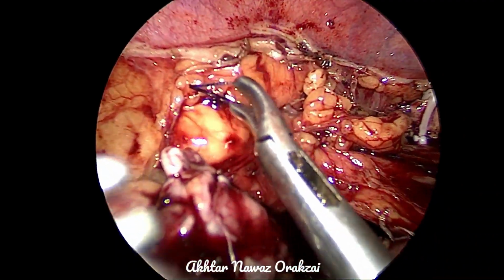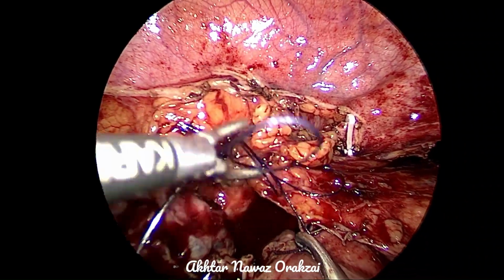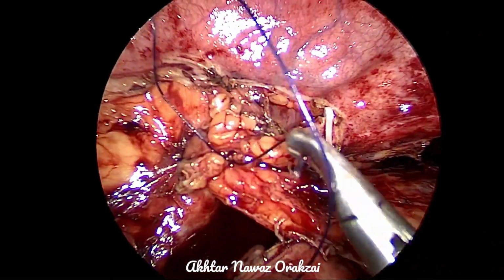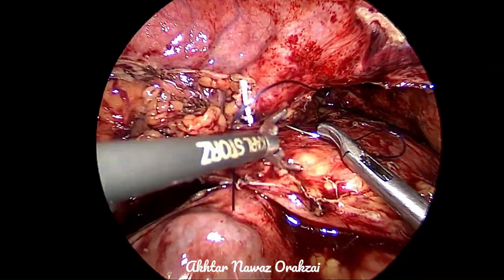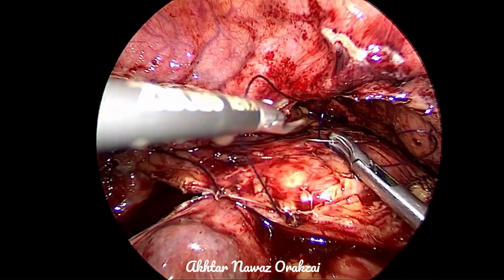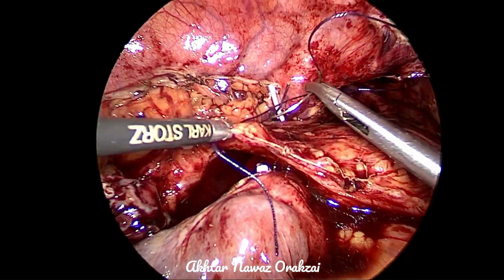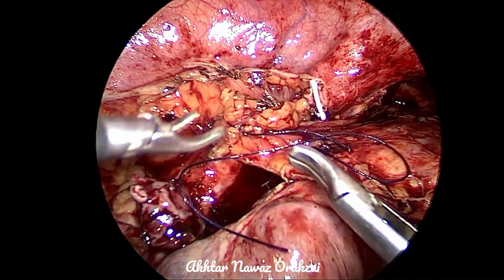So this mobilization of the bladder is of utmost importance in ureteric reimplantation laparoscopically. This is not done routinely in open procedure, but in laparoscopy, fixation of the bladder is really important. The bladder is empty, not completely filled. So when it is filled, it will become nearer to the anastomotic site.